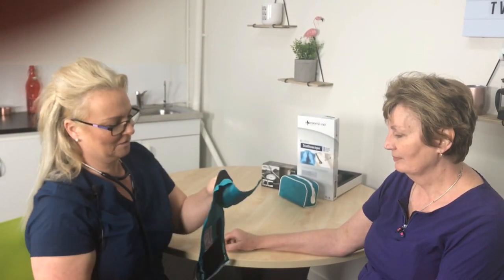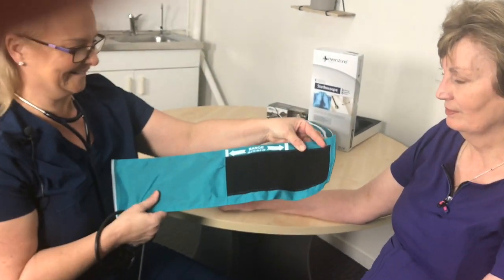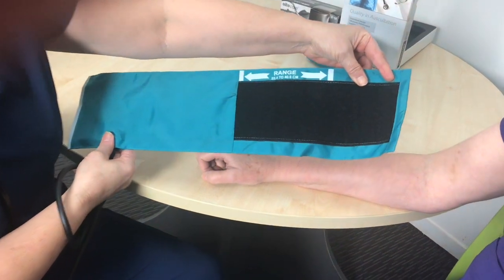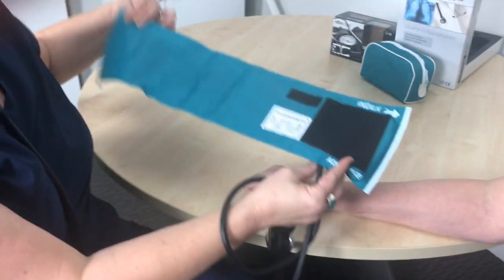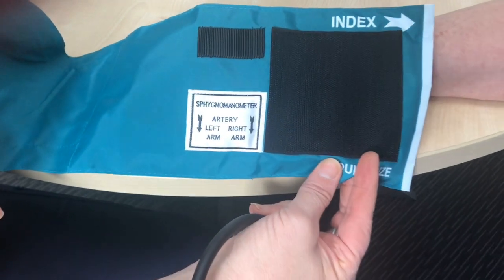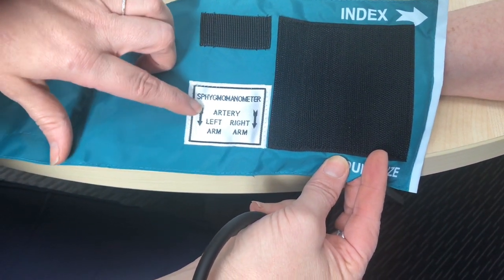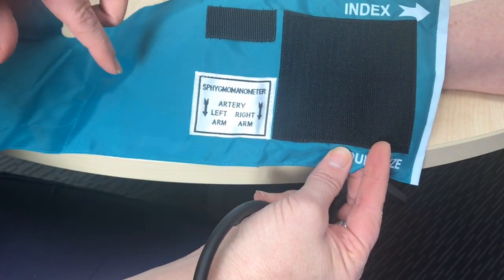We're going to look at how to take a blood pressure. On the cuff, on the other side, you'll see arrows that let you know where to actually apply it onto the patient's arm. These arrows let you know where the artery is.